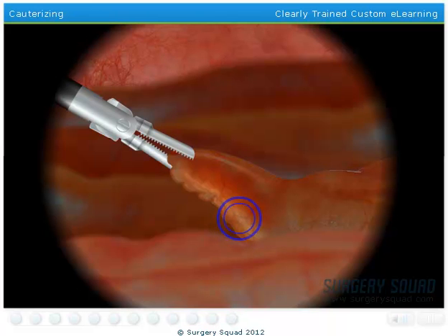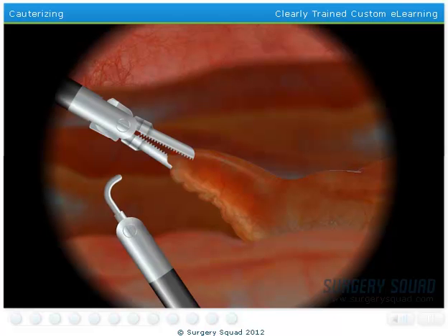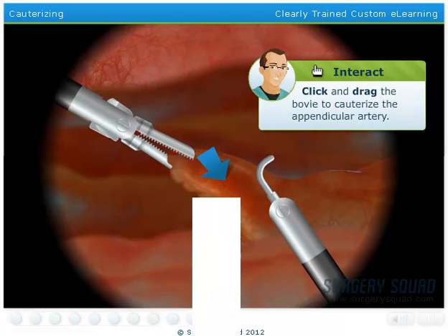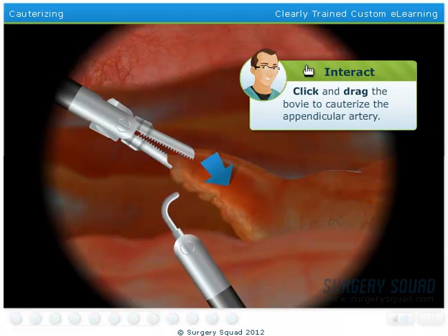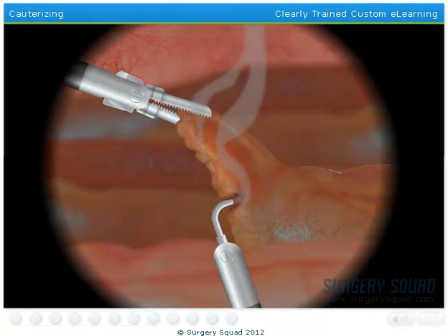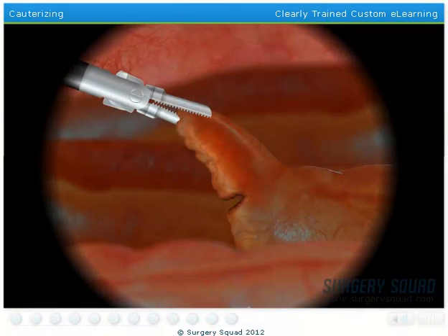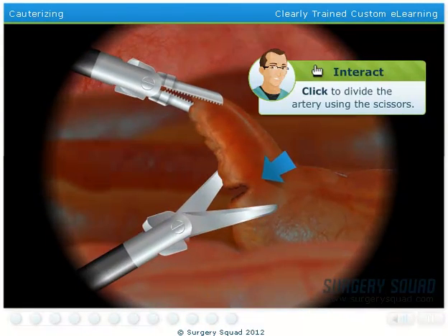The appendicular artery needs to be sealed using a diathermic instrument, which uses extreme heat to cauterize the artery. The artery is then divided using scissors.